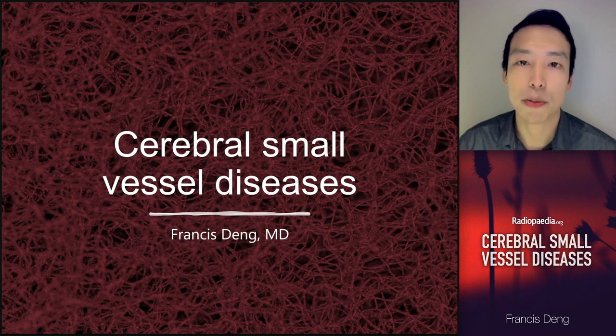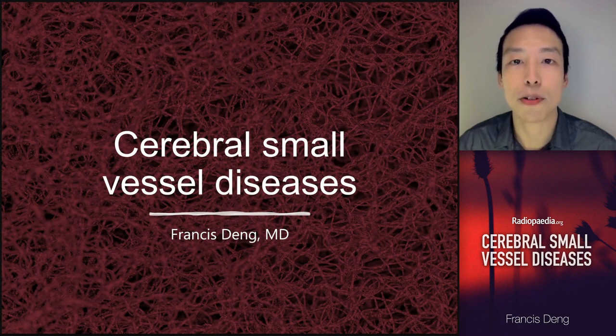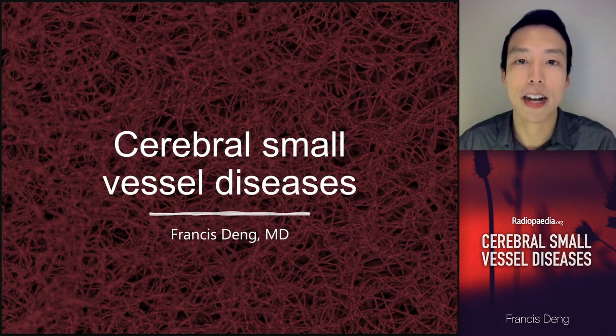Today we're going to talk about cerebral small vessel diseases. This is both a common and important entity. It's one of the most common causes of stroke as well as cognitive impairment in older adults. You may have come across the phrase small vessel disease in your first rotation in radiology residency because it's nearly ubiquitous. Those nonspecific white matter hyperintensities or hypodensities commonly related to small vessel disease.